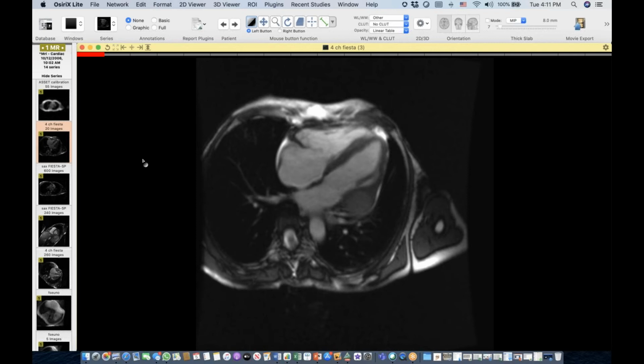That's a good idea, actually. Definitely, especially if there's a high suspicion, or if it's one of those tumors that we know tend to go to the heart, like lung, breast, and melanoma. When you do that, Phil, are you doing it with the same timing you would do for coronary arteries, or are you going a little later as more of a delay to get better enhancement in the myocardium to differentiate between that and the lesions?